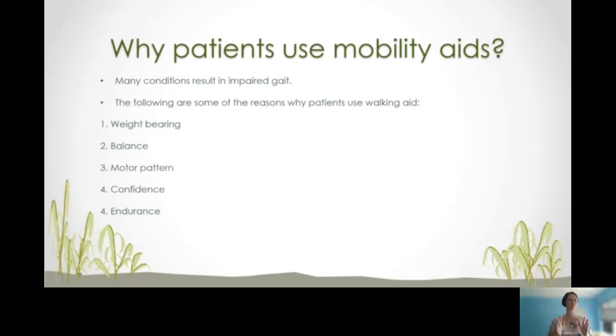Always remember individual preference and what you need for that patient. Number 4, it is often after an operation that they lack confidence, or even in our older population where they are fearful of falling.